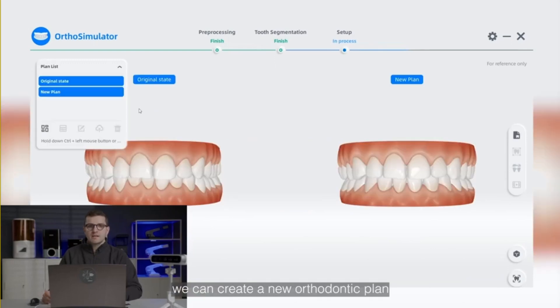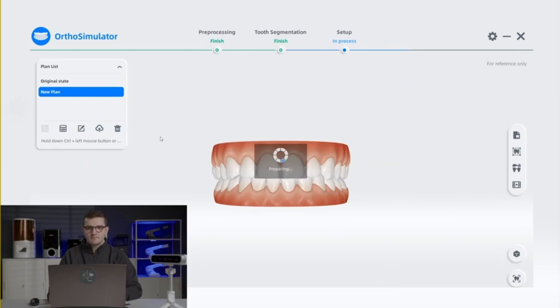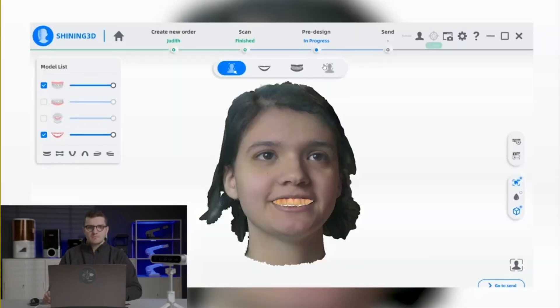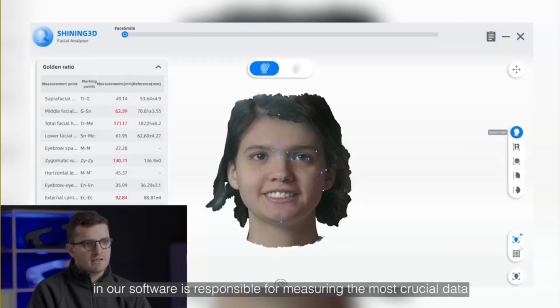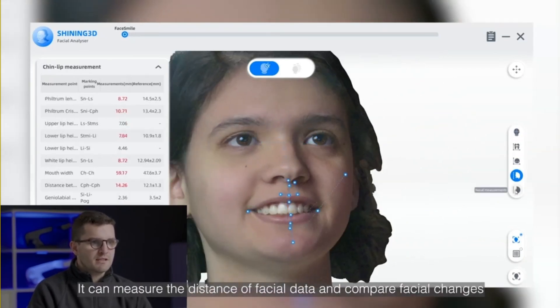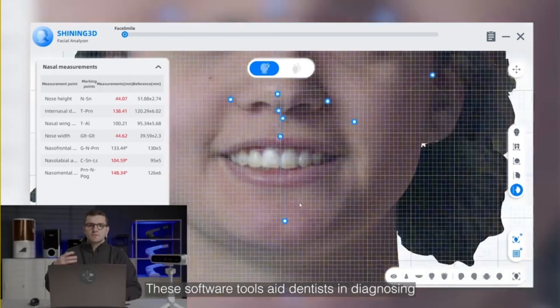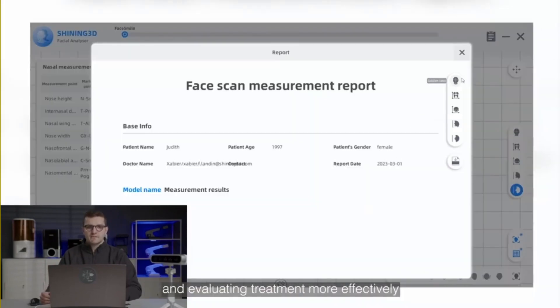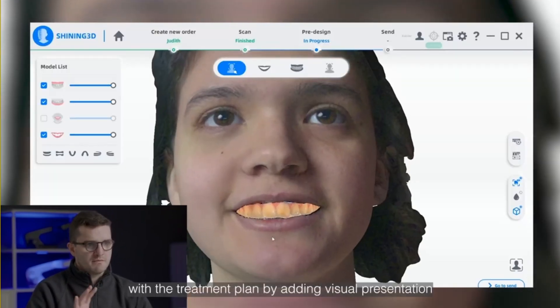Once complete, we can create a new orthodontic plan or make adjustments to an existing one. This information can be shared with customers using a QR code. The last module in our software is responsible for measuring the most crucial data from the scanned data. It can measure the distance of facial data and compare facial changes before and after treatment. These software tools aid dentists in diagnosis and evaluating treatment more effectively, while also improving patient satisfaction with the treatment plan through visual presentation.